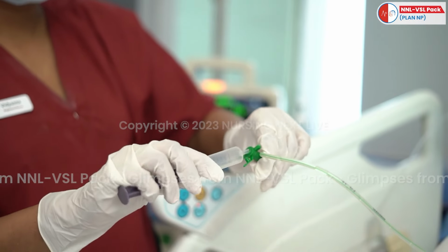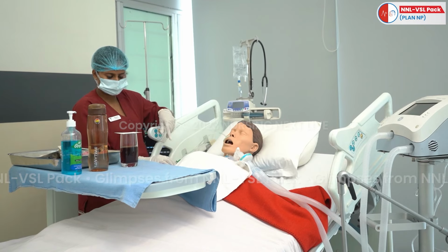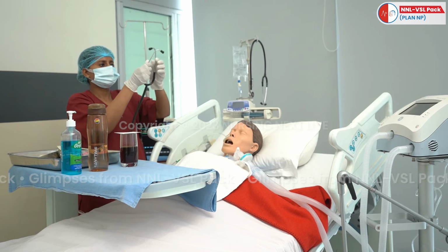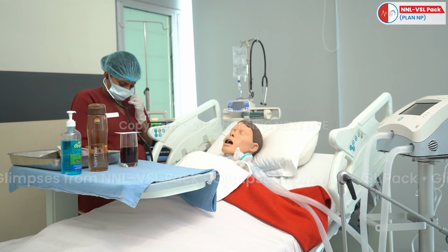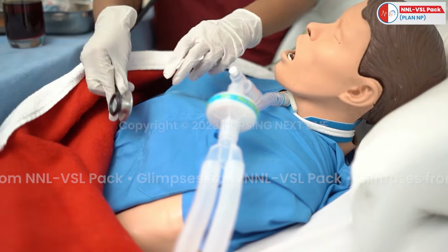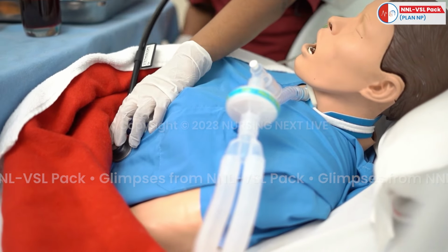Second, auscultation. Check the whooshing sound with the help of a stethoscope and a 10 ml syringe by flushing 10 ml of air into the stomach, along with the diaphragm of the stethoscope placed at the left hypochondrial region of the stomach.